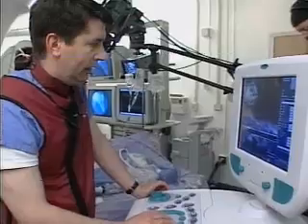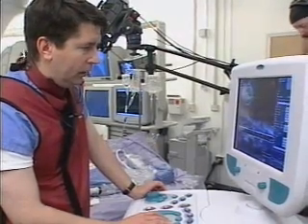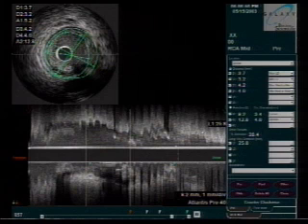Right. If you look back, if you still see the screen, Tim, I've now laid out this green line on the long view of the length, and the length between the two reference vessels from healthy to healthy is about 25 millimeters in length. So we'll probably, Bill, want to use a stent that's at least that long, somewhere between 23 and 28, I would suggest 28 millimeters, to make sure that we cover this area from healthy to healthy.